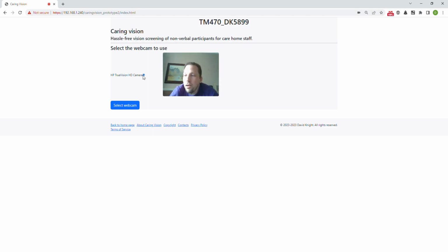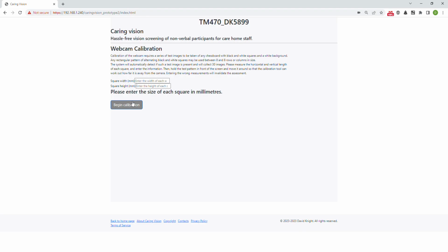Whilst you can see, I'm going to show you some of the extra tools you need in order to get this prototype to work. First of all, you're going to need some kind of tape measure. So I've got a normal tape measure here. You're also going to need a credit card sized object, so I've got my little membership card here, which I'm going to be using shortly. And finally, you need a chessboard, which I've got here. Again, a normal, quite an old chessboard, which is quite important because the whole point of this is that these are things that are commonly available in care homes. Pretty much every care home will have access to a chessboard. Tape measures and so on are commonly available tools that will be around in the environment that this is intended to work in.